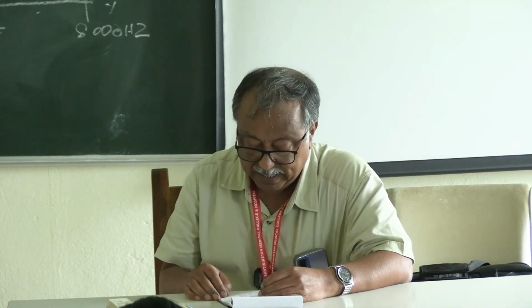Generally, if we do not mask, there is a chance of crossover. When you test one ear, it can crossover to the opposite ear. Now, coming to the degree of hearing loss. There are some differences of opinion, but normally it is mild 20 to 40, moderate 40 to 60, severe 60 to 80, and profound is more than 80.